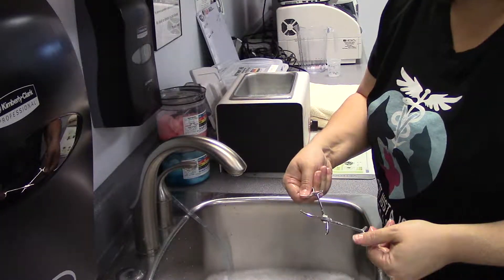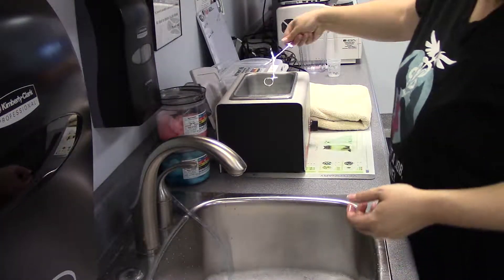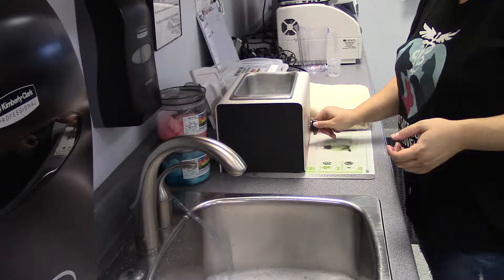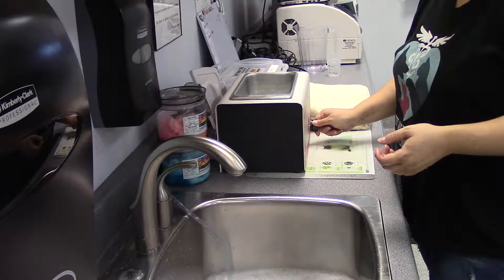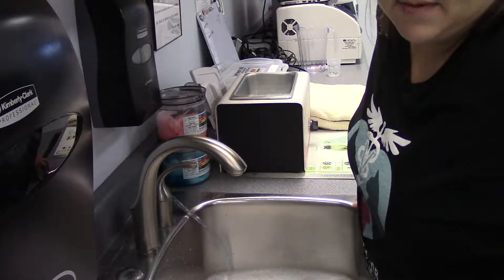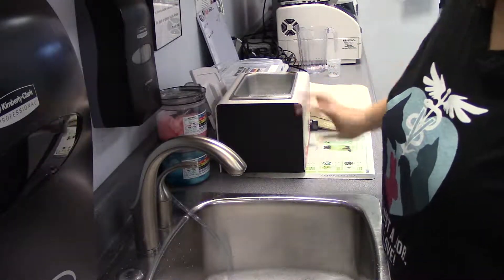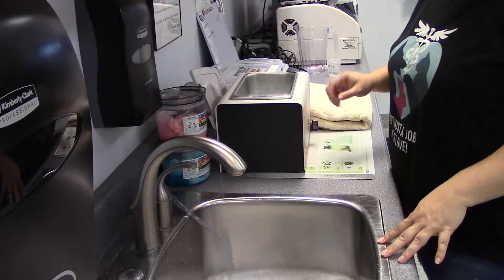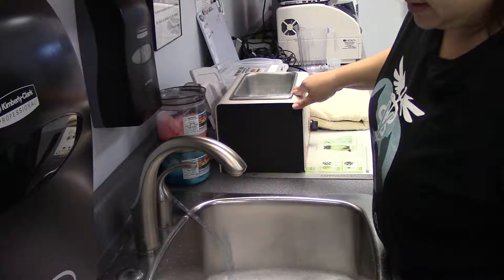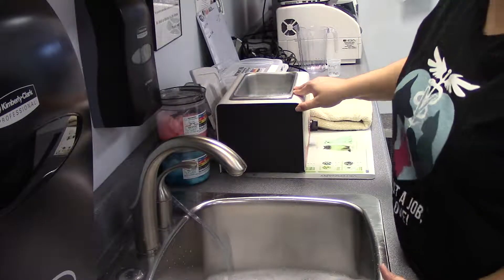Now we're going to place the instrument open into the ultrasonic cleaner, and we'll do this for about five minutes. I set the timer to five — I would let this run for five minutes. The ultrasonic cleaner has an enzymatic cleaner inside of it as well with distilled water.